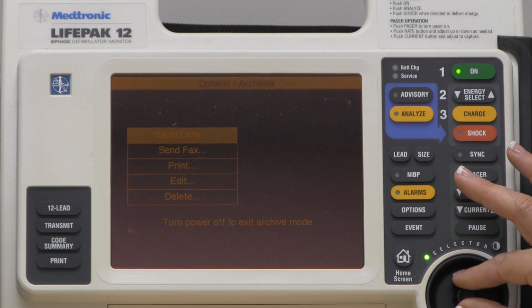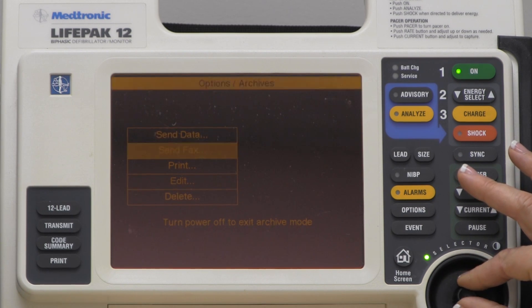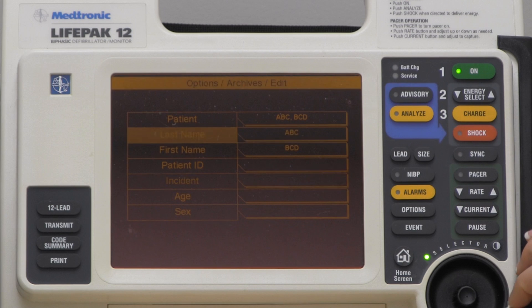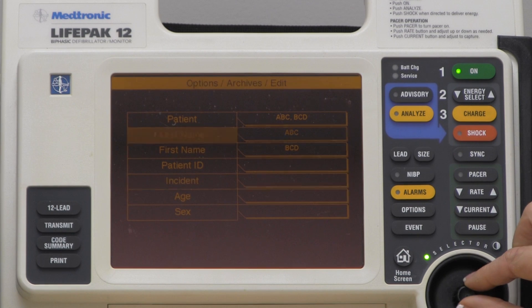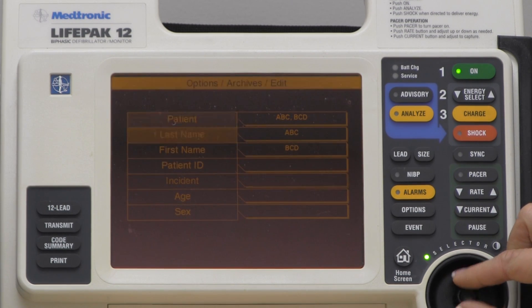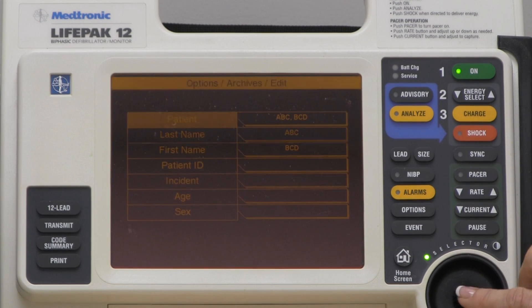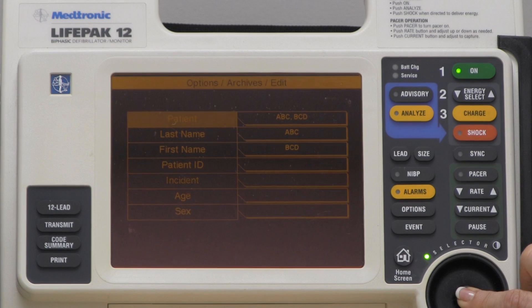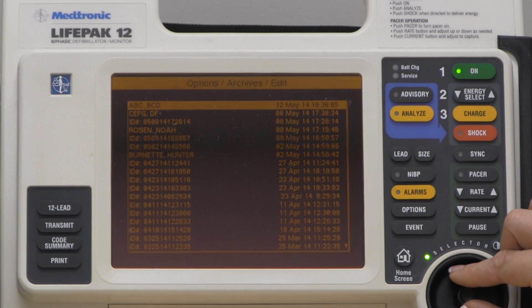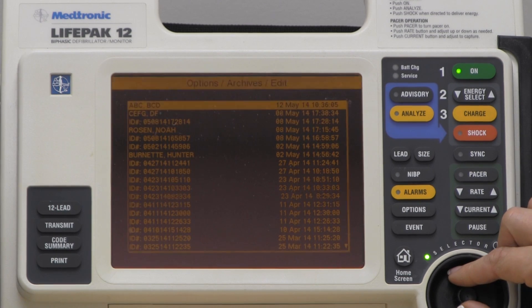Next, I scroll down, go to Edit, and then look for the patient that I need to put the name in for. I selected the patient and now I will look for the call that I ran that I need to put the patient's name in.